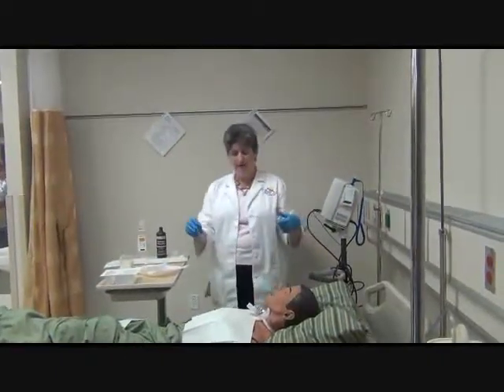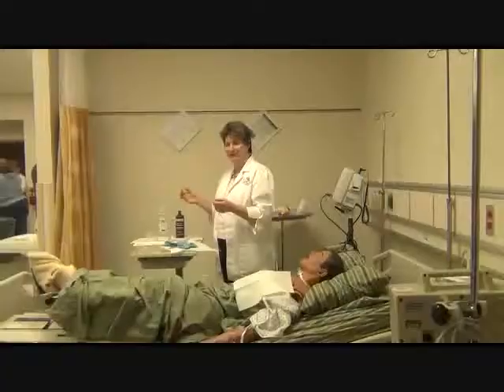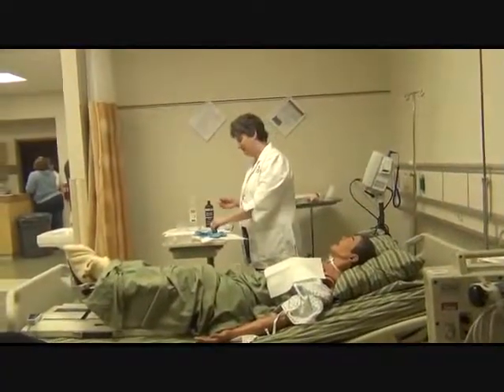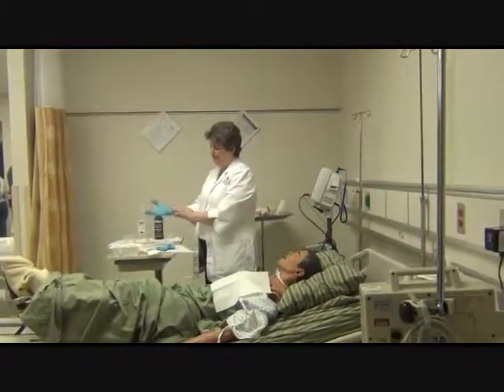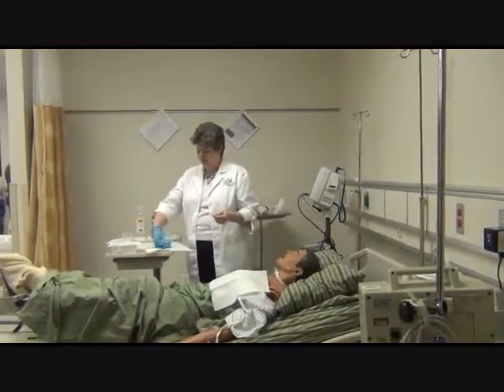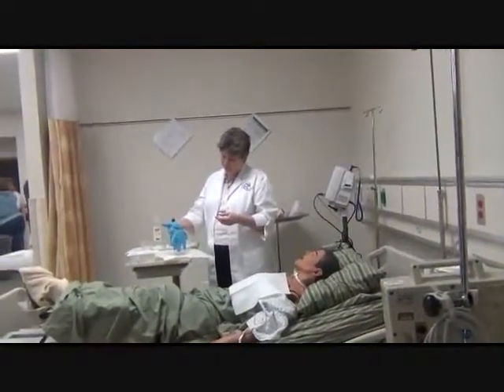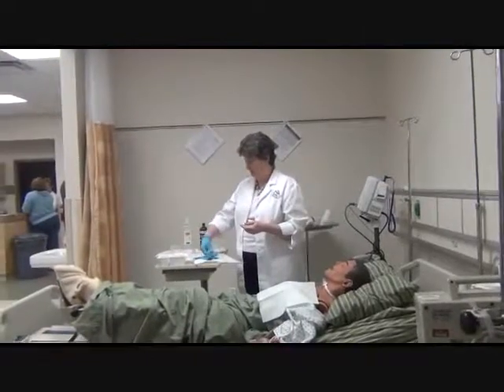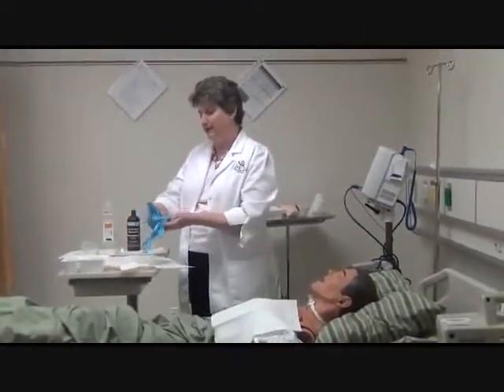Now, I found in my own practice that I've had times, so I open up my sterile gloves. I'm going to put my gloves on using sterile technique. It's just as easy to maintain your gloves as sterile when you're putting them on.